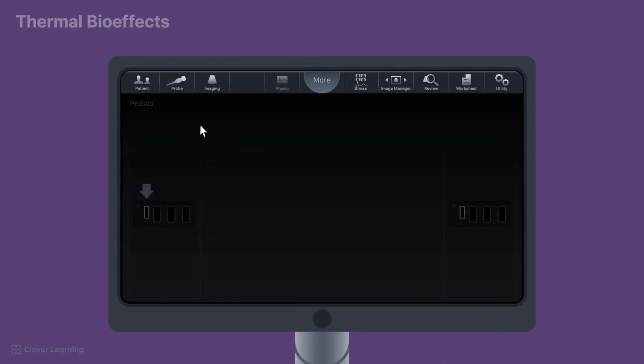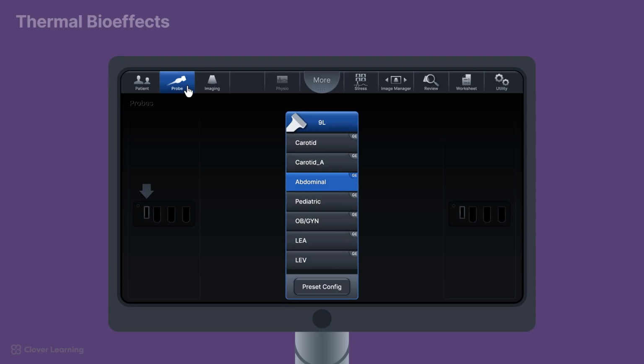Using the manufacturer's presets or imaging modes that correlate with the correct part of the body we're scanning can ensure the indices are balanced between power and image quality. For example, when scanning a fetus in utero, use an obstetric scanning mode instead of an abdomen setting, which commonly has a lower power rating.